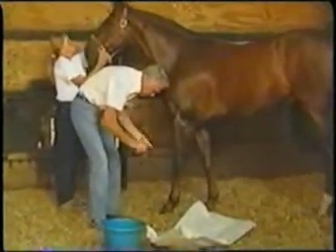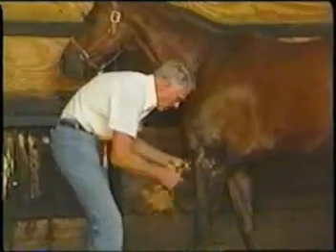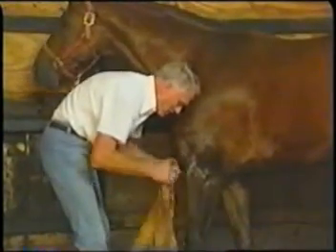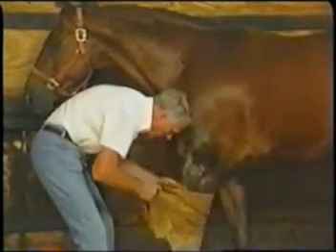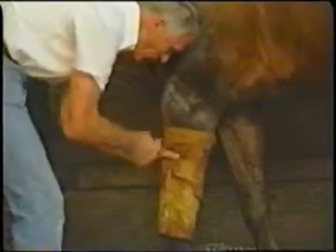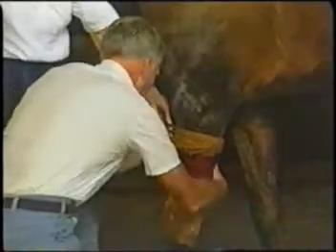Now here we are putting it on. Now in my hands I have a chamois which was soaked in water, and by using the chamois I have dampened or put lots of water on the horse's foreleg. Now you attach the chamois on first. The chamois gives the whole thing a good grip so that the stimulator will not slip off the leg afterwards.